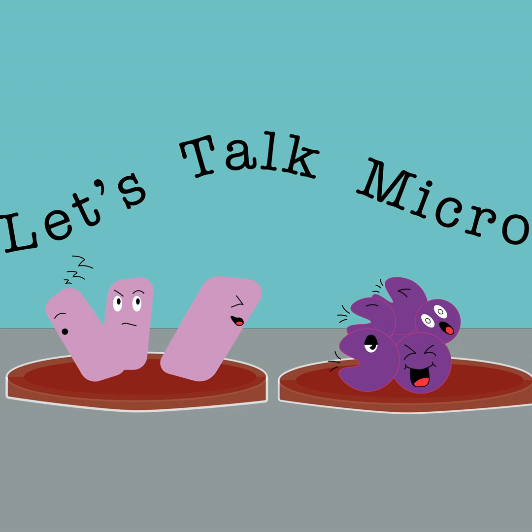Not every laboratory has that capability. If you do not have that capability, then you might consider adding a comment, or putting a comment in the medical record if you have that ability. You definitely want to communicate face-to-face with the clinician, but you always have to remember, and this is especially true at academic hospitals, that the clinician you're talking to today isn't necessarily the one caring for the patient tomorrow. So that one-to-one communication is important, but it's not the end of the communication when you're doing things like flipping results or hiding MICs. You definitely want to address, in whatever way makes sense for your system and your LIS and EMR limitations, the fact that you might have something called resistant with an MIC that looks very susceptible.